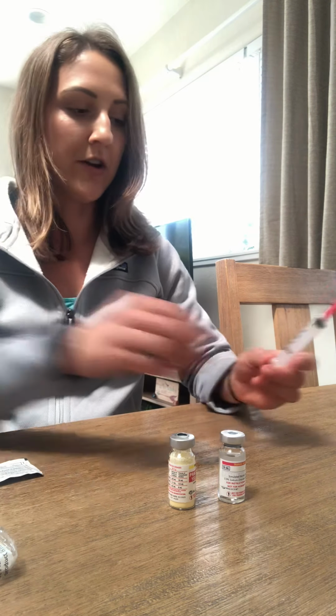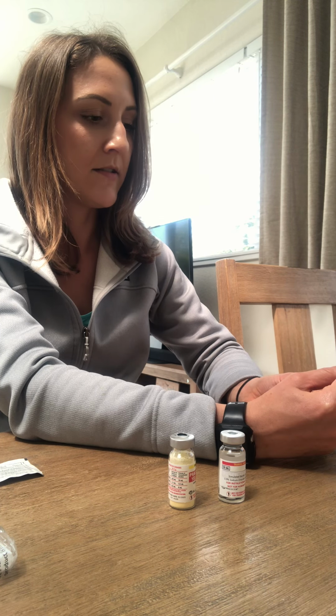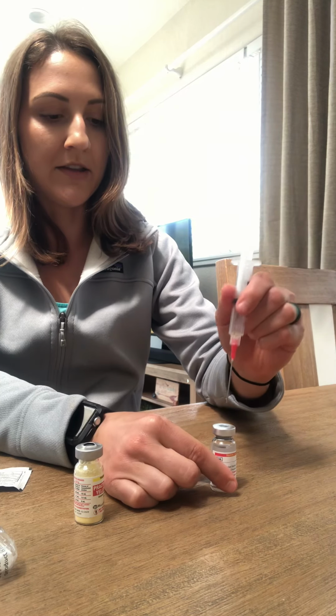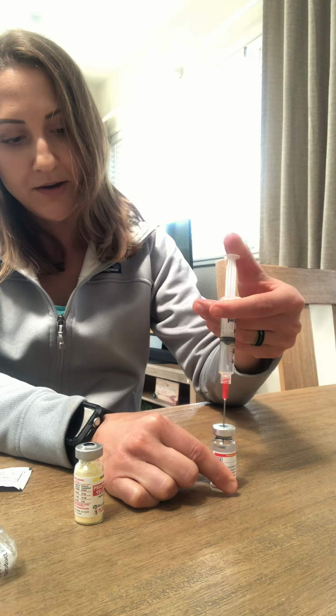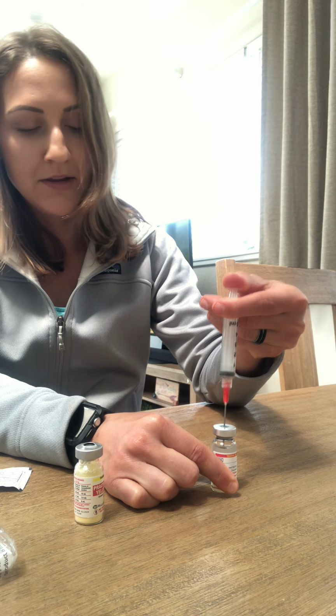Then I'm going to be drawing up the amount of diluent that I need in air, and taking off the syringe here. I'm gonna place the needle in the diluent, keeping it above the level of the liquid. I'm gonna expel the air.